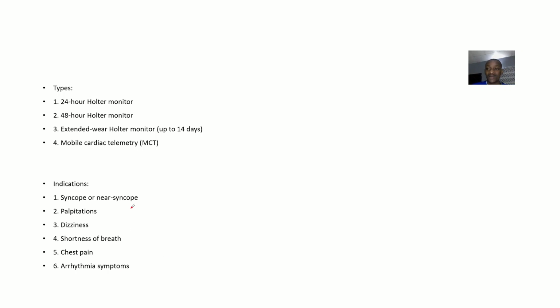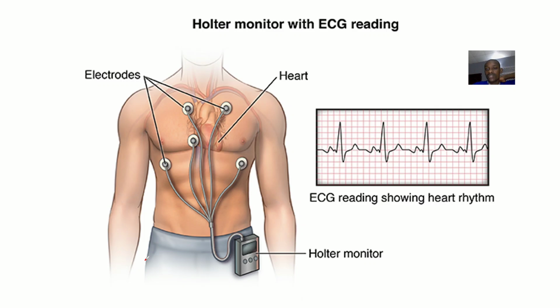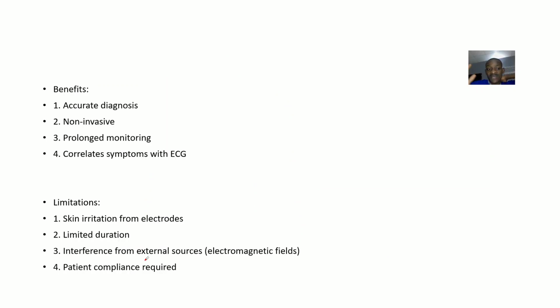So if they complain about syncope, that's fainting, or near syncope, that's near fainting. All right. If they complain about palpitations, dizziness, shortness of breath, chest pains, or any arrhythmia symptoms, all right, you can just give them that so that you can monitor them throughout the day.